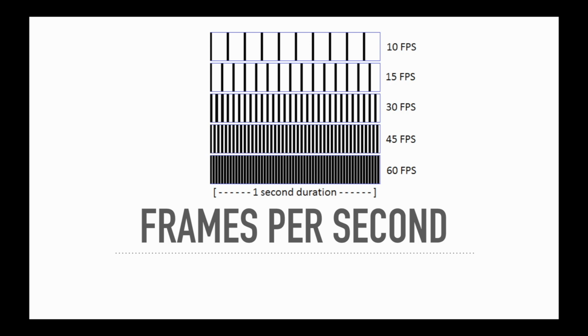If you look at this little image here, you can see how at 10 frames per second you're just getting one frame, and then there's a lot of missing information before the next frame. Go up to 30, and if there's a structure moving, you'll still miss some information, but you'll get a lot of it. At 60 frames per second, you're almost at 100% of the information, where you're not missing anything in between. The frames show you an image, then it waits, and then shows you another image. While it's waiting, there's information going by, whether it's a moving heart or some structure in the body, maybe blood in a Doppler image, that's moving by before the next frame is shown.